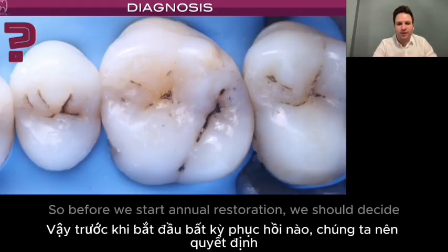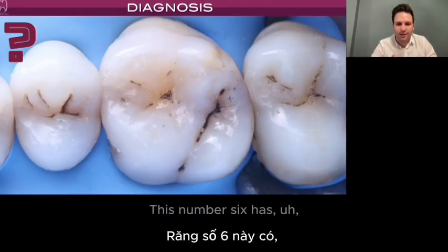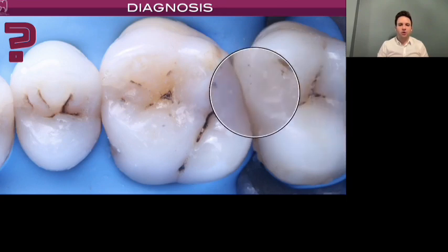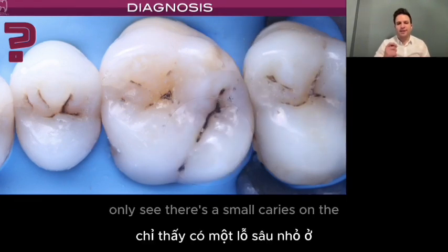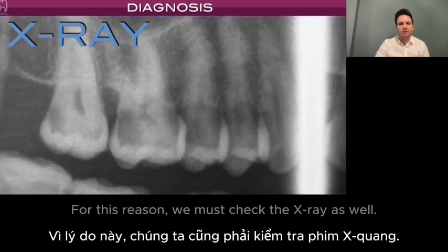So, before we start any restoration, we should decide what kind of treatment plan we have. For example, in that patient, this number 6 has some color change on the distal side, but when you just check intraorally, you can only see a small caries on the distal side of the tooth. For this reason, we must check the X-ray as well.